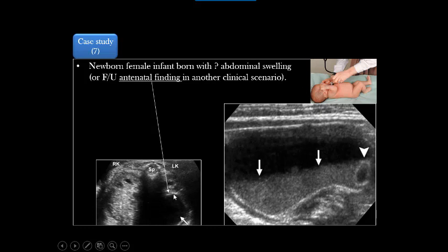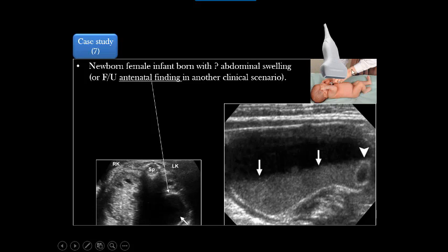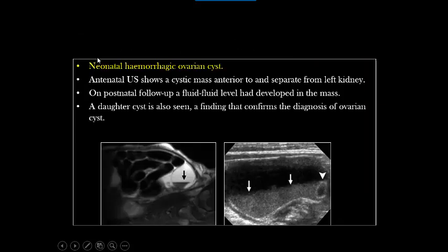Another case: a female neonate with a large swelling detected by the clinician or antenatally. Postnatal follow-up showed a large pelvic abdominal complex cystic lesion with a fluid-debris level and daughter cysts. Daughter cysts suggest ovarian nature; fluid-debris level suggests the cyst is complicated. A complicated ovarian cyst carries a high risk of torsion. Torsion is actually more common in intrauterine life than in neonatal life. In all cases we use a linear probe for higher resolution. This was a neonatal hemorrhagic or complicated cyst — daughter cysts with float-float appearance — complemented and confirmed by MRI.